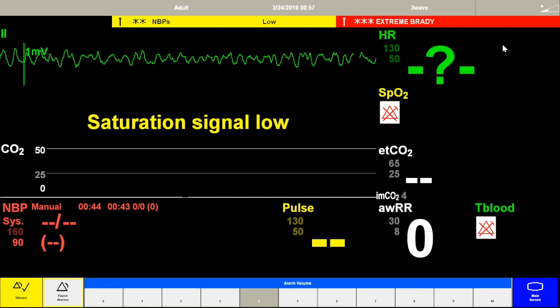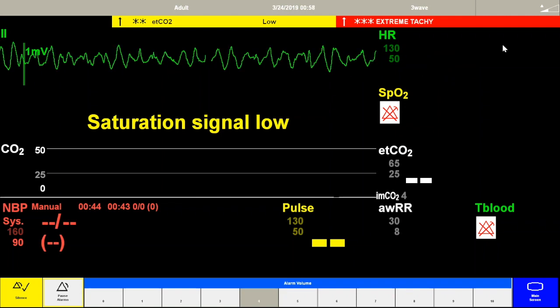Let's review. The person presented with a wide complex tachycardia — a polymorphic VTach, Torsades — and deteriorated. We noticed the respiratory rate dropped, as well as our square waveform, and the end-tidal CO2 dropped. We started CPR and performed basic BLS at a high-performance level. The signal continued to change, the QRS complex deteriorated even further, and at this point we're in ventricular fibrillation and haven't been able to convert. We would try defibrillations in between each two-minute cycle and then consider ALS interventions.